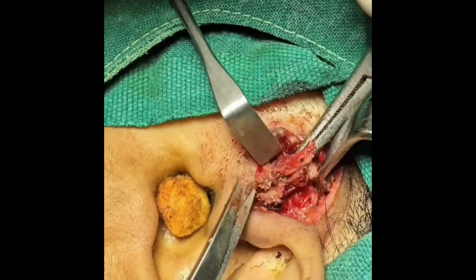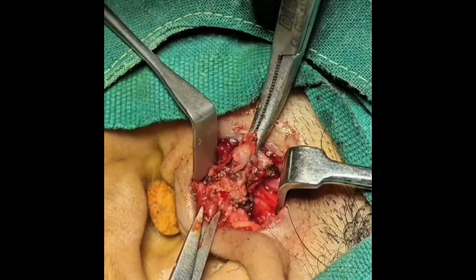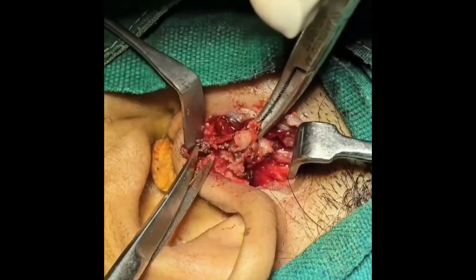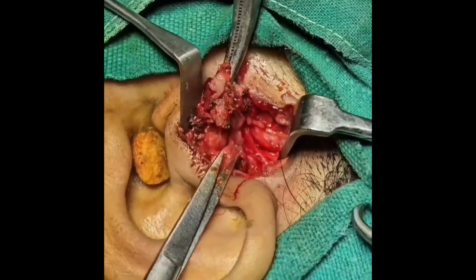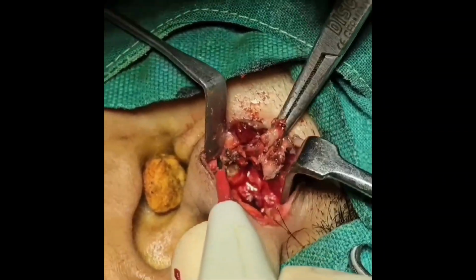So that was the area of the abscess. The tract was going up to that area. And posteriorly, of course, like I said, excise just anterior to the helix. So whatever tissue is present has to be included in your dissection specimen, so that no part of the tract is missed. This is a deeper part of the tract which you can see.